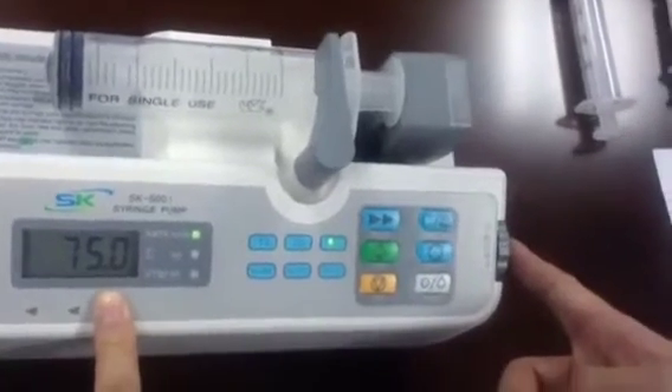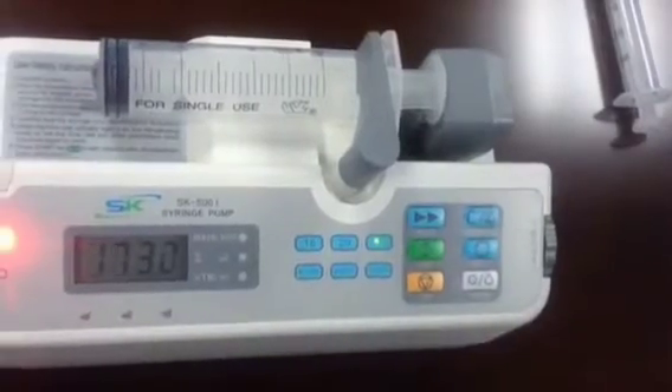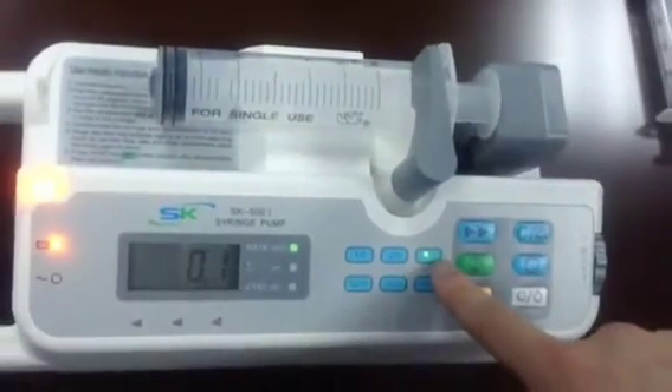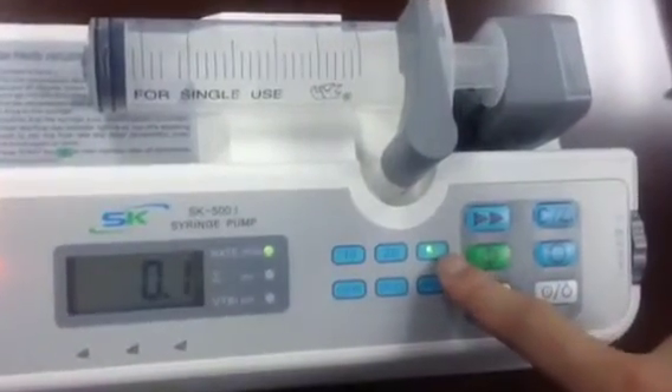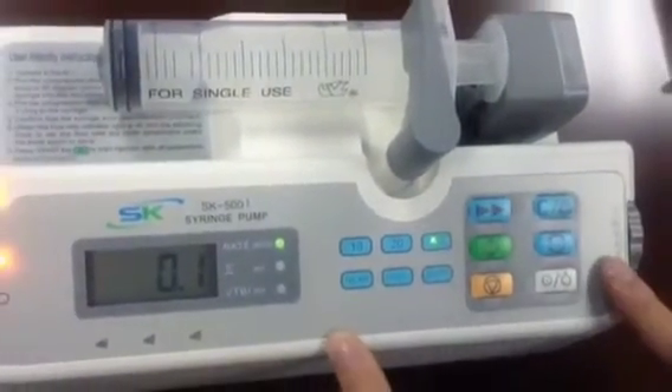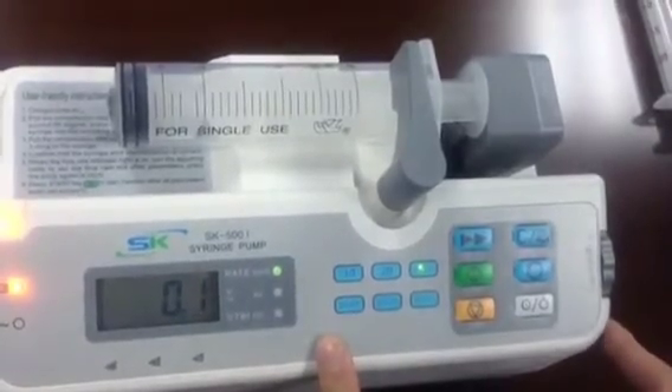Press the knob to the left to save the value. The 15 mm indicator light is now on, which means you have finished the calibration for the 15 mm syringe correctly. Then power off.